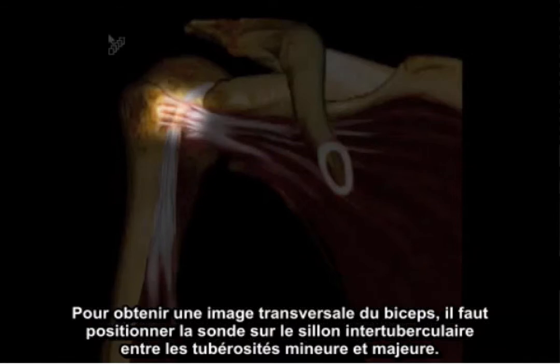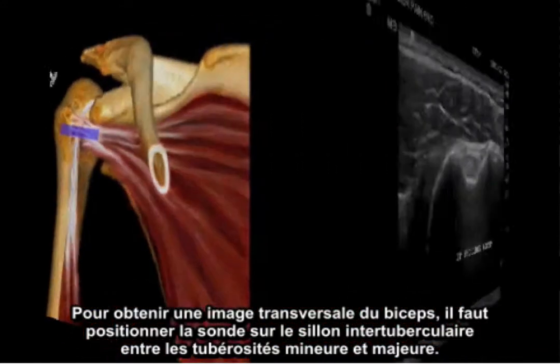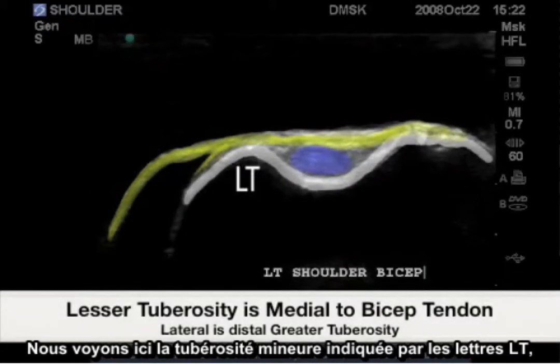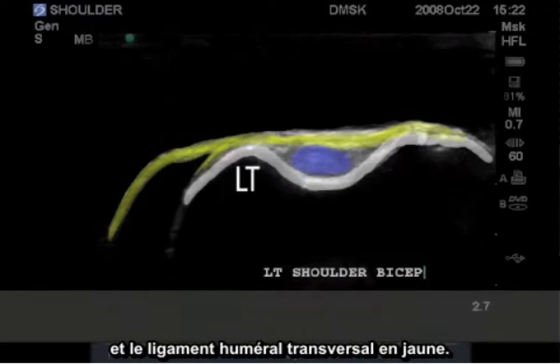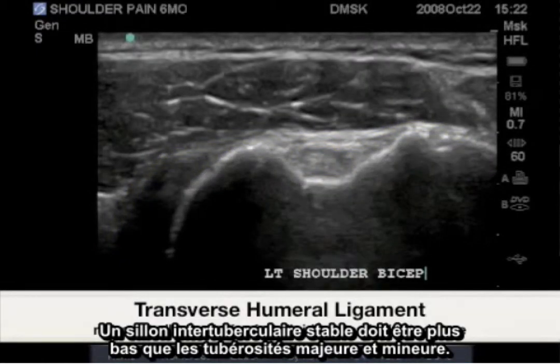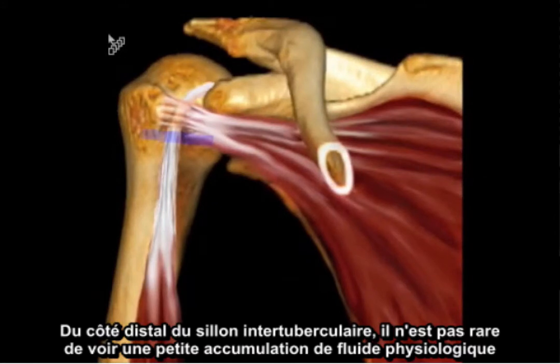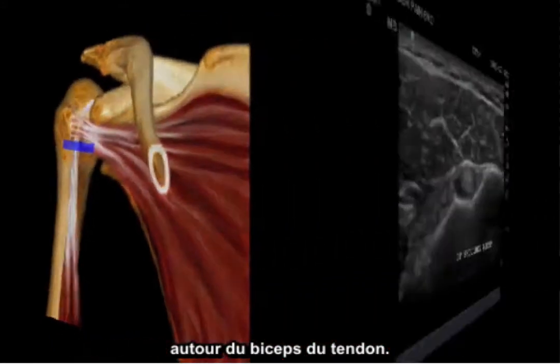Probe placement for the transverse bicep image begins over the bicipital groove between the greater and lesser tuberosities. Here we have the lesser tuberosity labeled as LT, the bicep tendon is colored blue, and the transverse humeral ligament is yellow. A stable bicep groove will be lower than the greater and lesser tuberosities. Just distal to the bicep groove, it is not uncommon to see a small amount of normal physiologic fluid accumulating surrounding the bicep tendon.